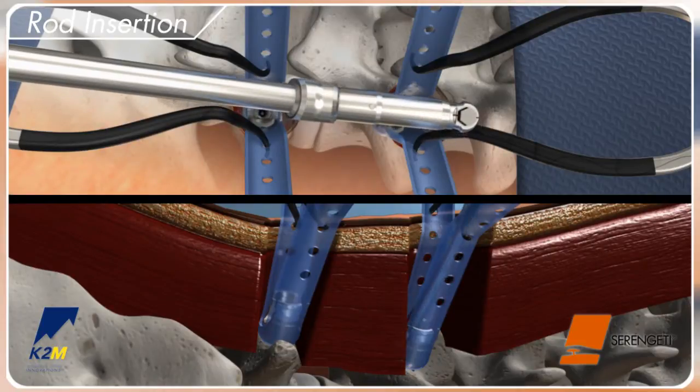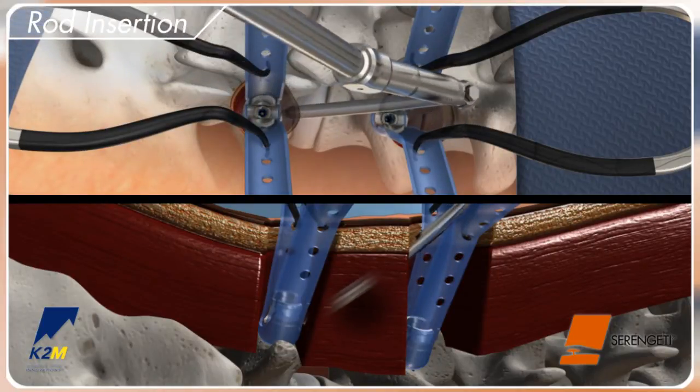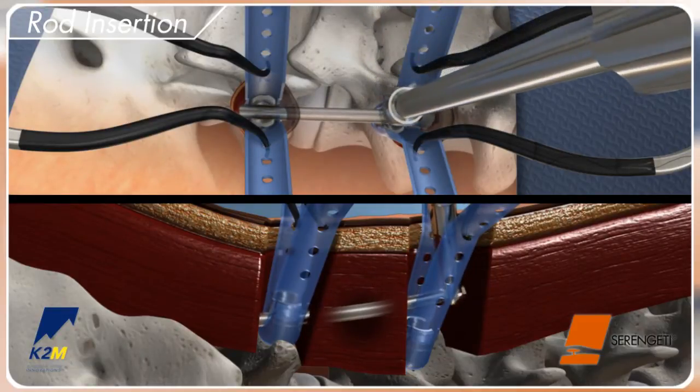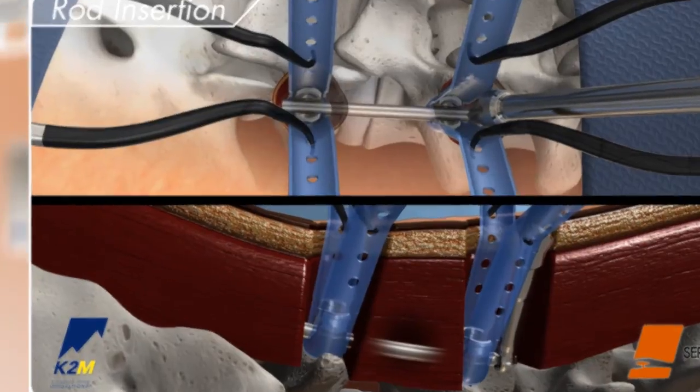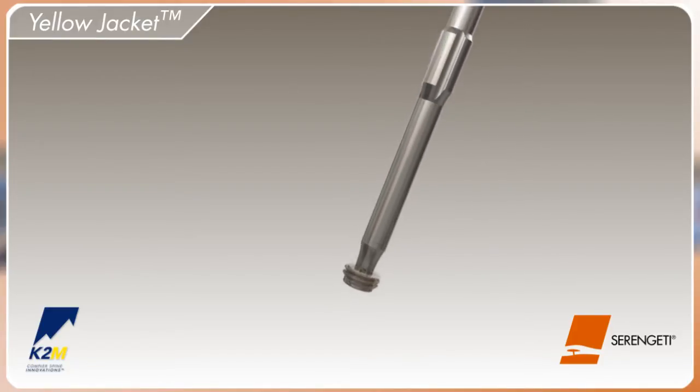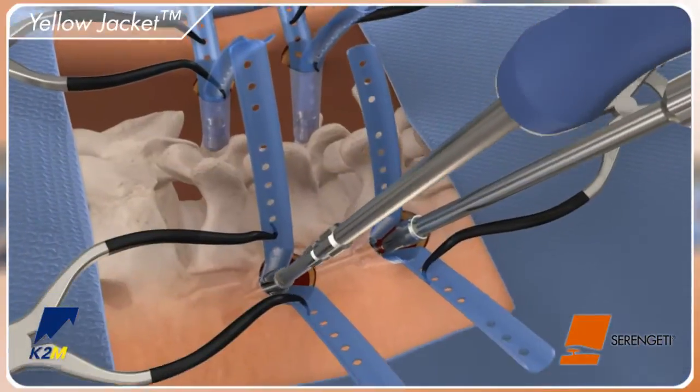Insert the rod by using the tapered tip to slide through the muscle tissue, and use the direct visualization afforded by the Serengeti retractor to pass the rod from screw head to screw head. Attach the offset screw to the short provisional screwdriver by applying a downward force to engage the hexalobe tip and thread into the implant housing.